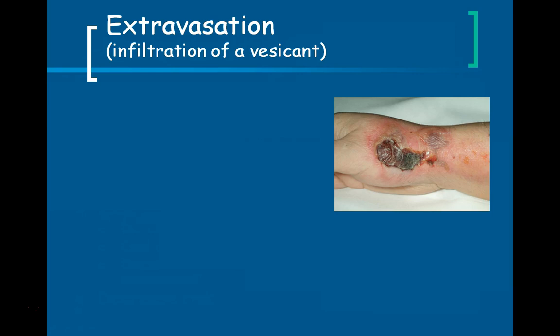Also, many types of antibiotics are also very irritating. And often in the procedures and policies, there will be a document discussing some of the IV solutions or medications that are especially damaging to the tissue.